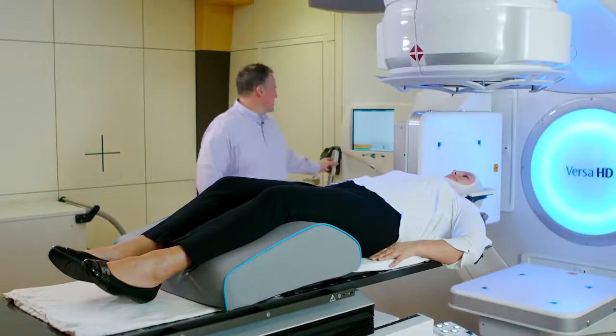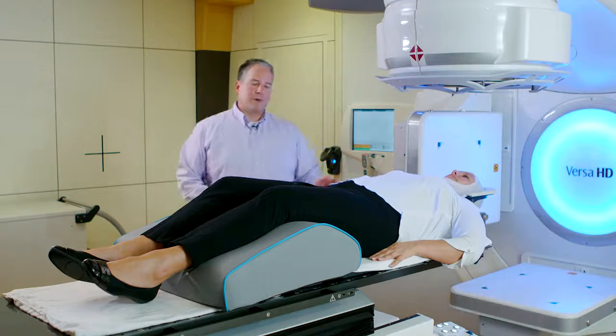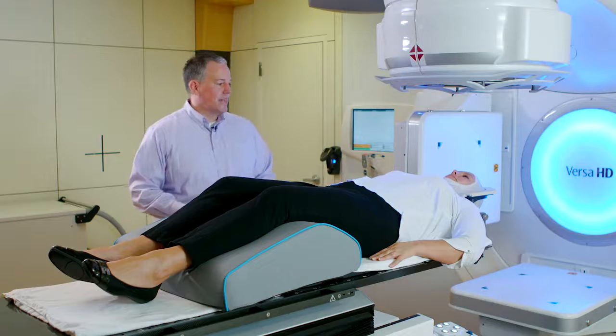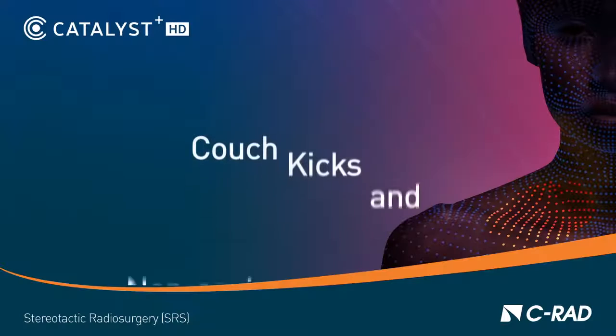Now our patient is in position. Catalyst will do another calculation that will make sure that the patient is properly positioned and fine-tuned, and then we'll be ready to do our imaging and treatment as well.